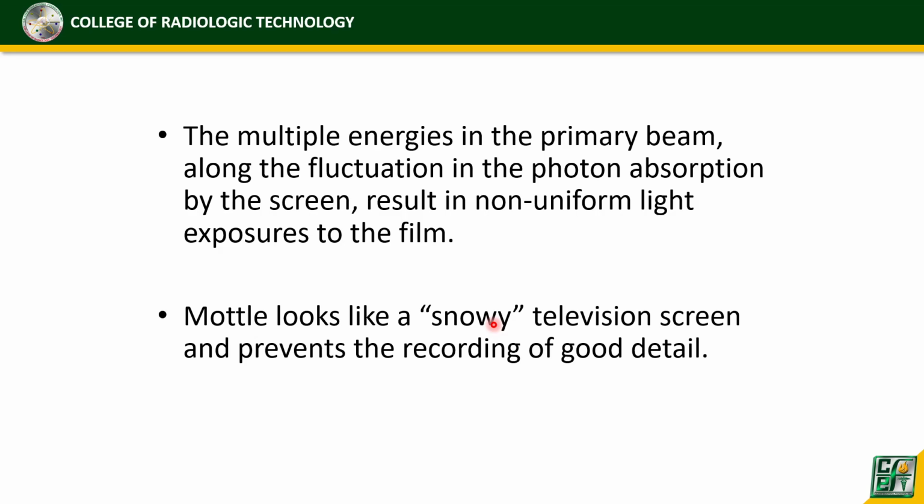So mottle, ang mottle ay sabi ito, it looks like a snowy television screen. So, I don't know if familiar kayo doon sa mga televisions na kapag walang program or pag walang channel, walang signal, particular channel. Yung para lang siyang white siya na parang gumagalaw-galaw, parang static. Inabutan niyo ba yung mga TV na gano'n? So yun yung parang pag walang cable or walang signal galing sa antena, nagaganon. Yun yung mottle na tinatawag.